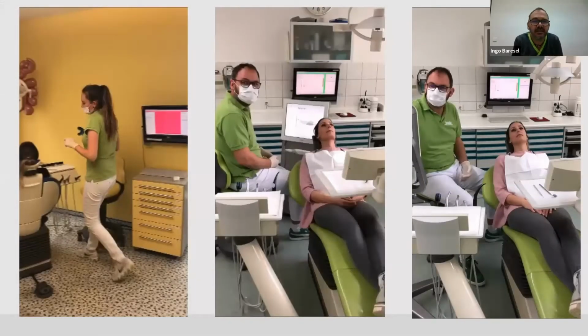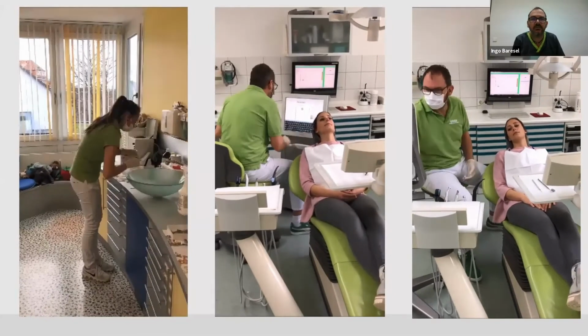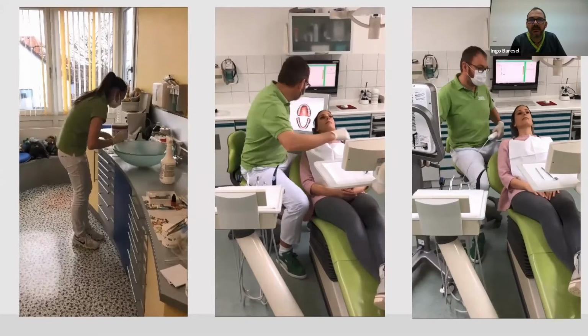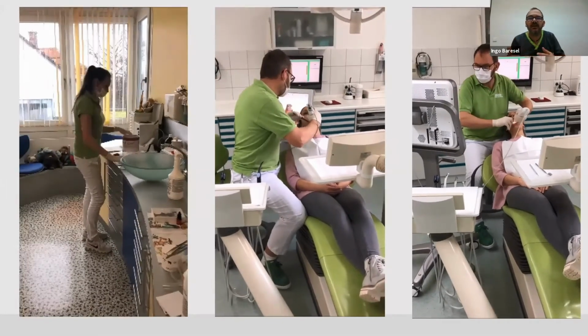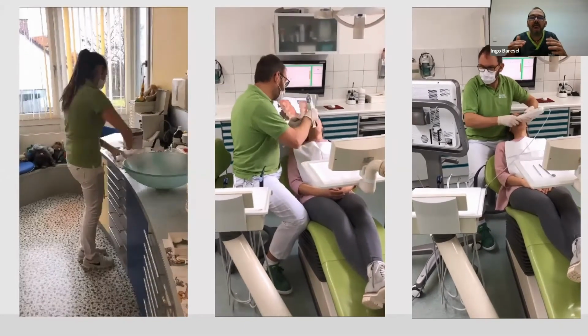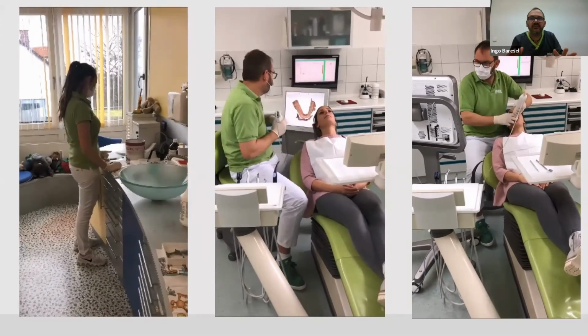And scanning is fast. I want to show you in these videos that scanning is faster than taking analog impressions. You see on the left side, one of my assistants is doing an alginate impression on upper and lower, and me scanning with a Trios and with an iTero, the same patient without any assistance. And you will see how fast I am with scanning. And I programmed the scanner. I have no assistance, but it's really easy.